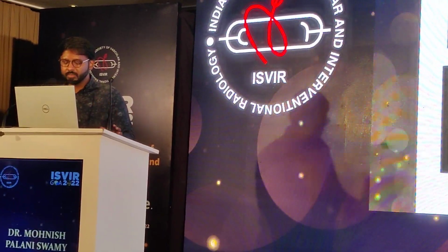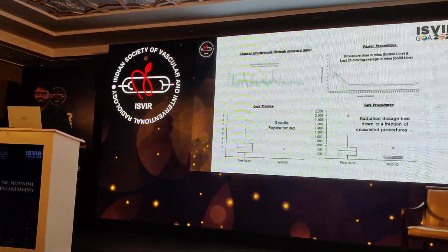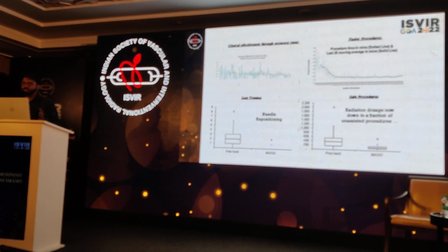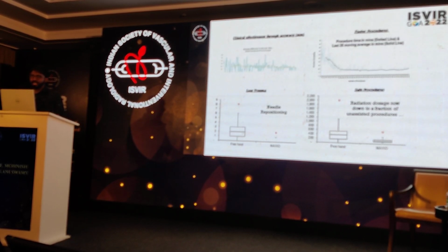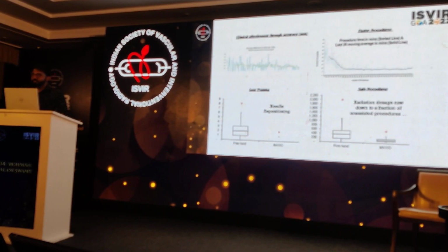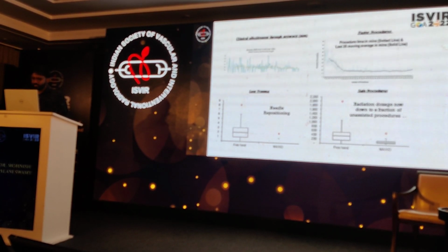Whereas there is a learning curve to it, because in a study done in a different place, they say that over a period of time the clinical effectiveness and accuracy increase, and you can start doing procedures faster, from 25 minutes to 10 minutes, and it causes less trauma. Instead of repositioning the needle 5-6 times, which I've had difficulty with when there's a moving lymph node, or if it's not planned properly, or if you don't have a person to help you, once you use these machines the needle repositioning time comes down, and the radiation dosage to the patient also comes down.